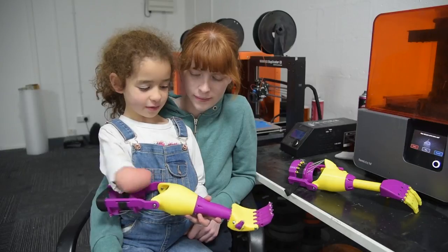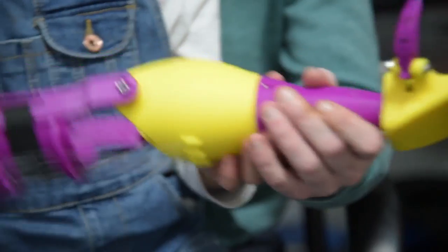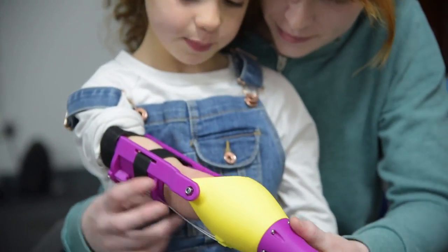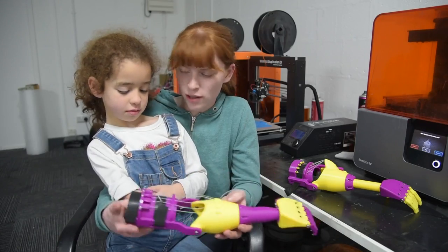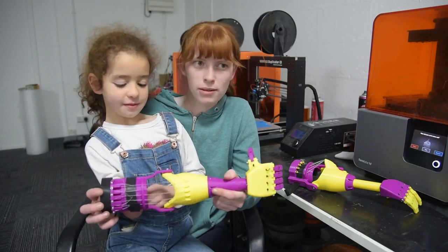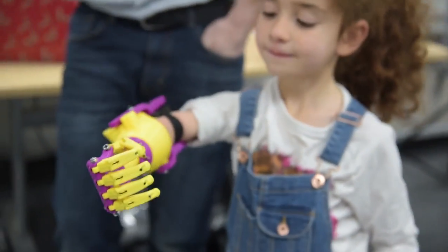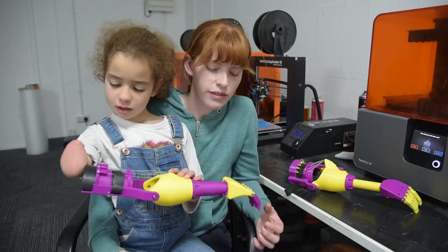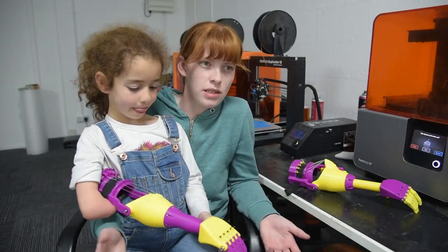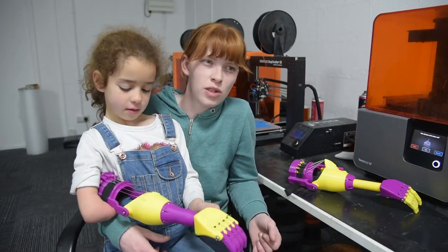It's a 3D printed prosthetic arm that we inquired to get for Charlie, and we made it as bright and colorful as we possibly could, didn't we Charlie, so that Charlie would be proud. We went and I was looking on Facebook and there was a post of a program on Channel 4 called Shed of the Year, so I contacted them to ask if it was possible to get a prosthetic made for my daughter and they said it was an 18 to 24 month waiting list.